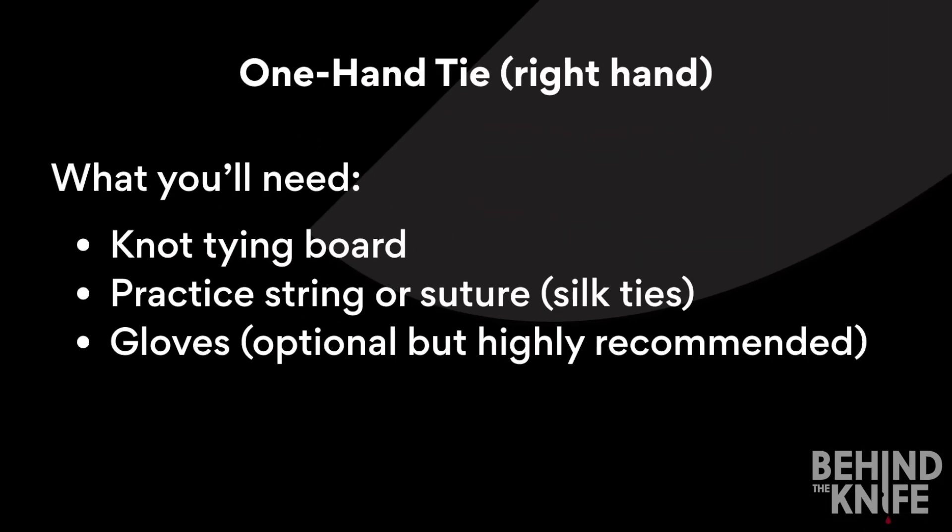Today we're going to review how to do a one-handed knot tie. For this we'll need our knot tying board, our practice string or suture — O-Silk ties work best — and gloves are optional but I highly recommend them.